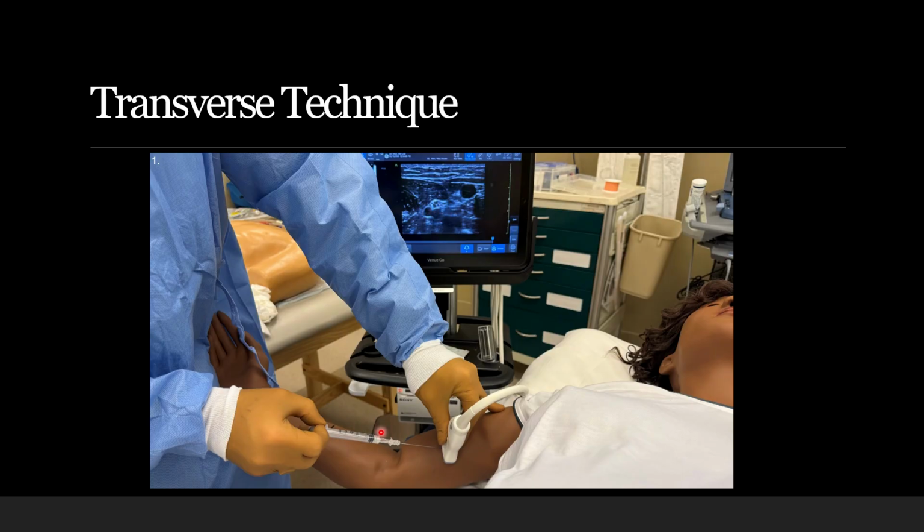When you're progressing, and again, we'll cover this shortly, your needle is going to start passing through, but one big caveat is you can see this image is very thin. You can blow right past that needle. And we'll go over some techniques of how to avoid that later on.